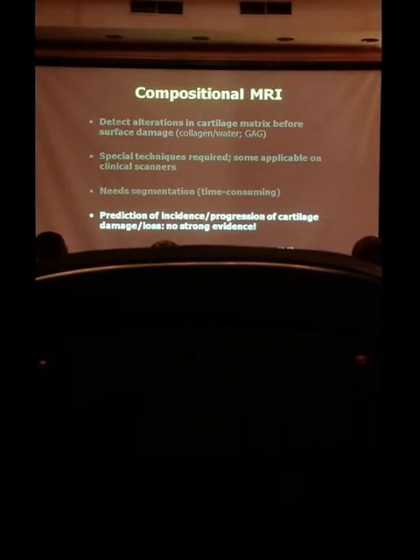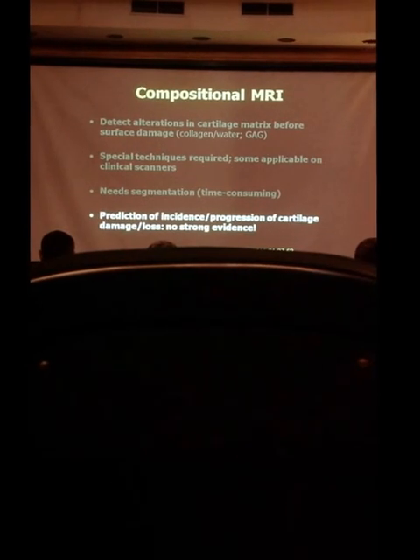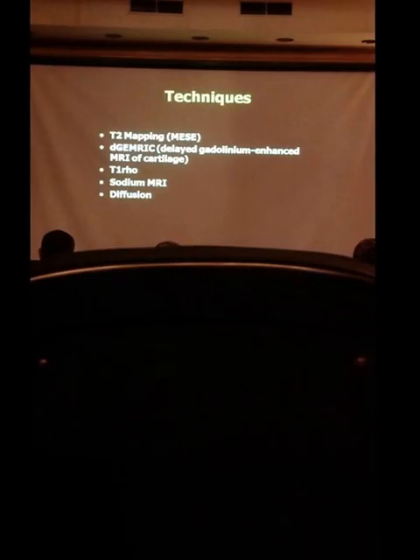And for the prediction of incidence and progression of cartilage deterioration or loss over time, we don't have to date strong evidence showing that these very early degenerative changes that we find using compositional techniques lead to loss of cartilage or deterioration of the joint in the long term. We don't have such evidence.